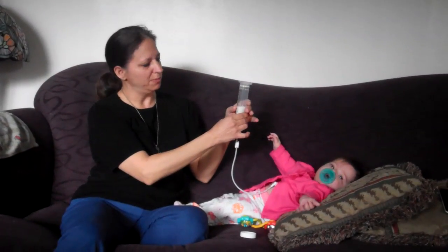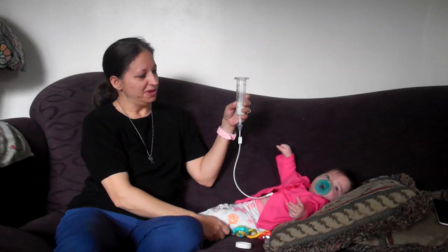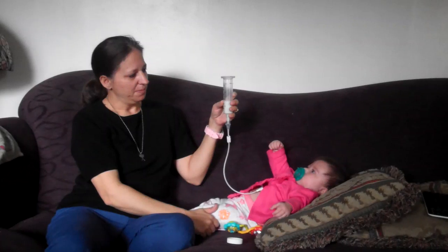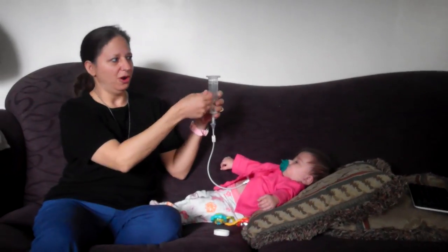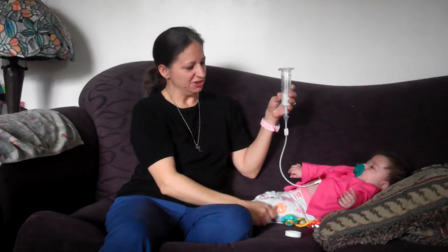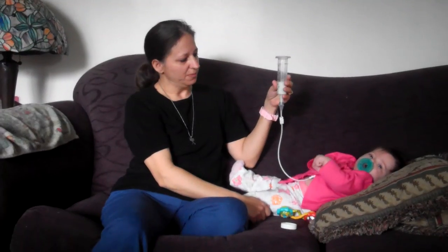Sometimes when I'm feeding her, I'll put my thumb on a certain spot if I'm not sure it's actually going down. I forgot the plunger. If I'm not sure it's going down, then I can see and know for sure. And you can see here that it is going down. Now at first we had to use, I forgot the other part, but you can push down in here. It's like a little plunger, and it was intimidating at first, but that would just help to push it down just a little bit to get it going again, if it should stop moving.